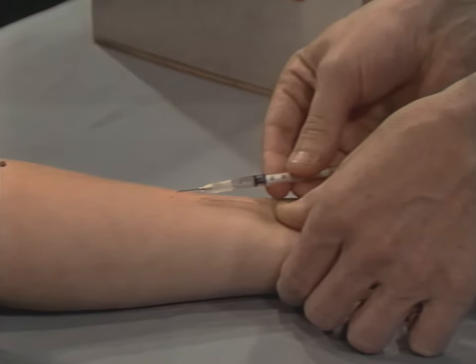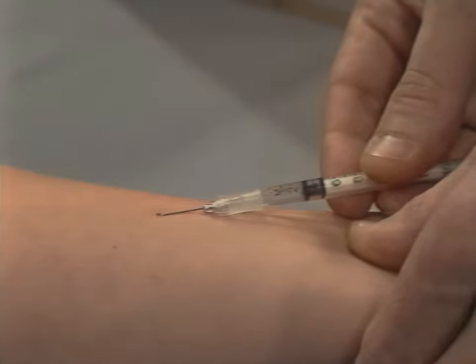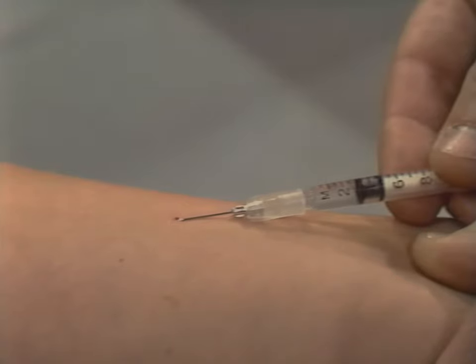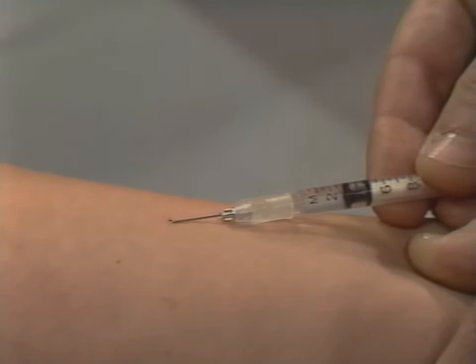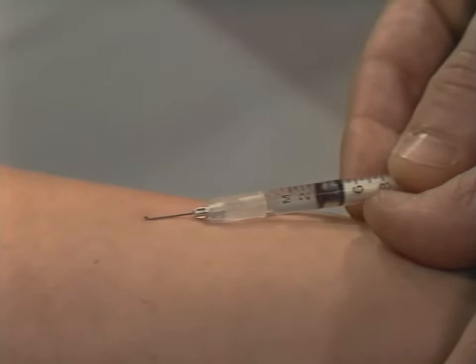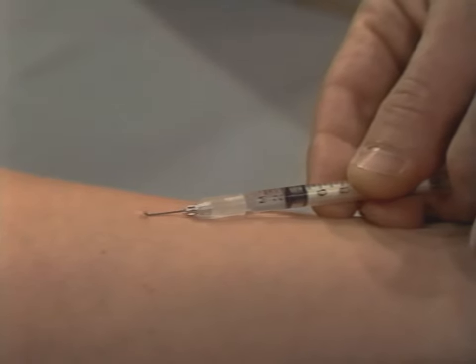Next, stretch the skin tight across the forearm at the injection site. Hold the syringe so that the needle is at a flat angle, almost parallel to the skin, about 15 degrees. Insert the needle only enough so that the cutting edge or bevel penetrates the skin. When the needle has penetrated the skin, you can use your other hand to operate the plunger.